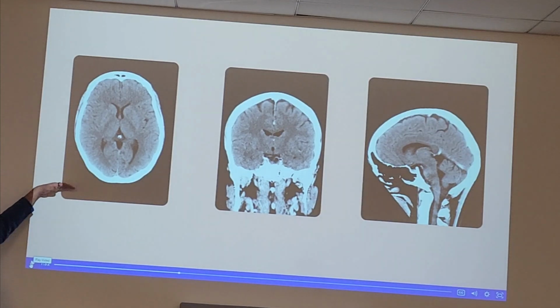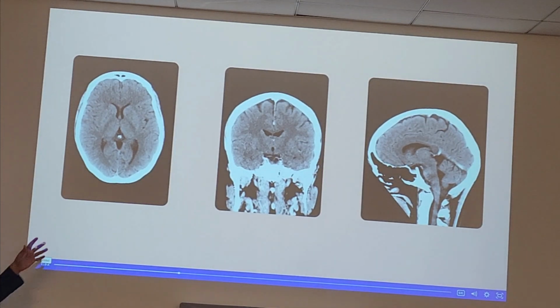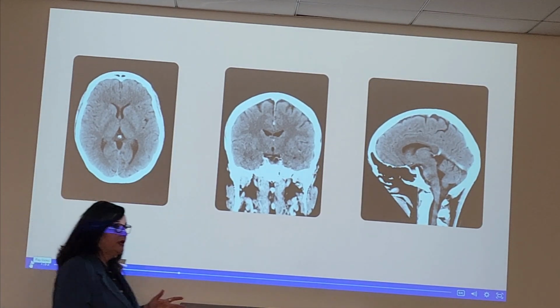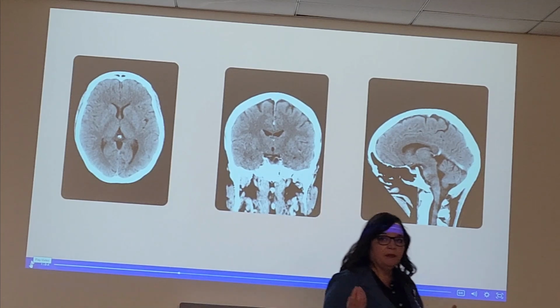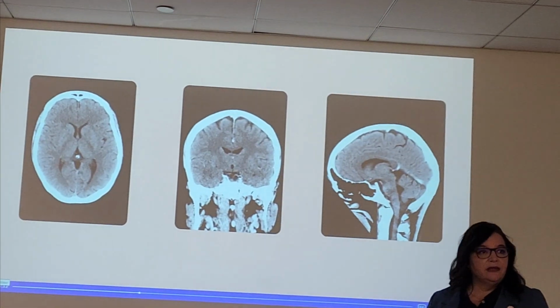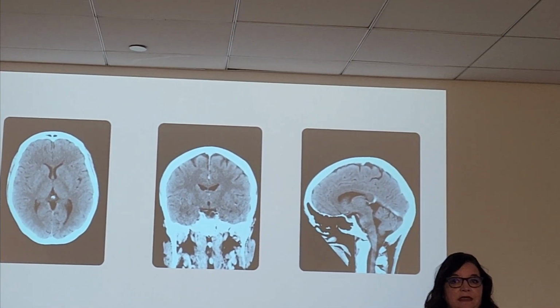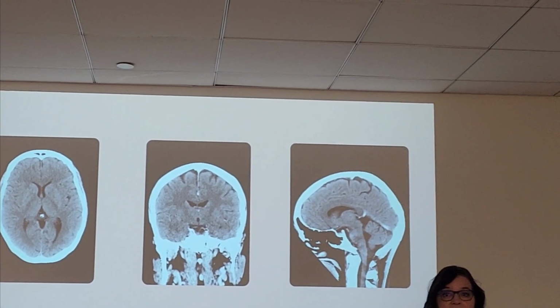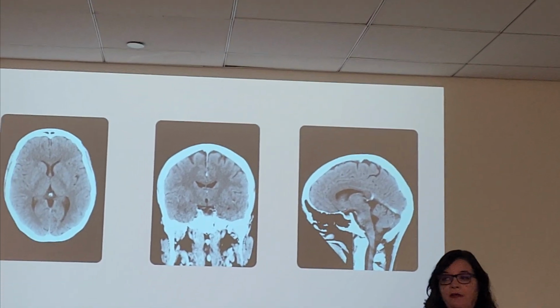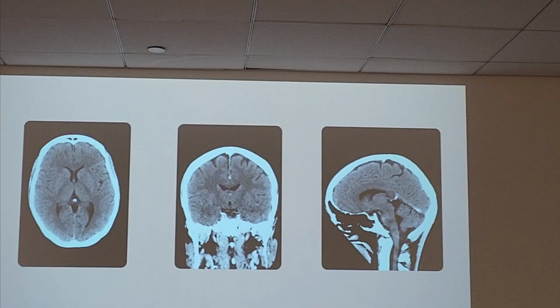Also, we talked about, what was the other one? I said stroke, cancer, right? Cancer is another reason why we would start implementing CT. When you think about radiation therapy, what is combined with radiation therapy? What kind of imaging modality is fused with radiation therapy? CT. It is the CT machine. Okay? All right. Awesome. Y'all are with me. I love it.